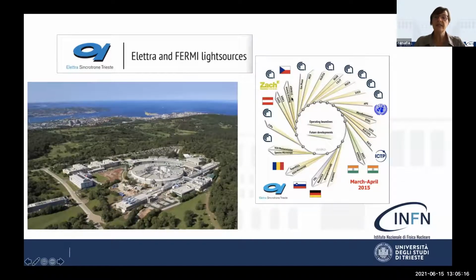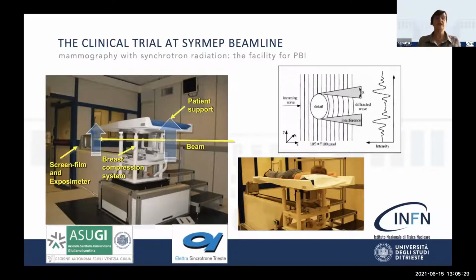At Elettra, we have the SYRMEP beamline, which means synchrotron radiation for medical physics. This is the beamline that has been developed in order to exploit X-ray imaging, especially propagation-based imaging. As Luigi introduced before, we performed a mammography study, and this is the patient support that we developed. Obviously, the study was in collaboration not only with the Elettra Synchrotron Trieste, which is the host institution, but also with the University Hospital of Trieste.